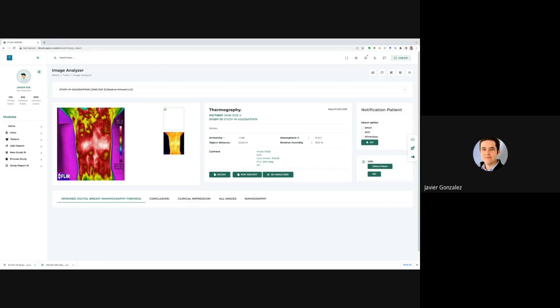I have one question. That Miramai software, is it web-based, or do you have to install it on your computer? I don't know. I think it's web based. I think it is too. I mean, if they're smart, it'd be web based, right? Yes, because it's portable. You can run it everywhere, on every single computer and your iPad.